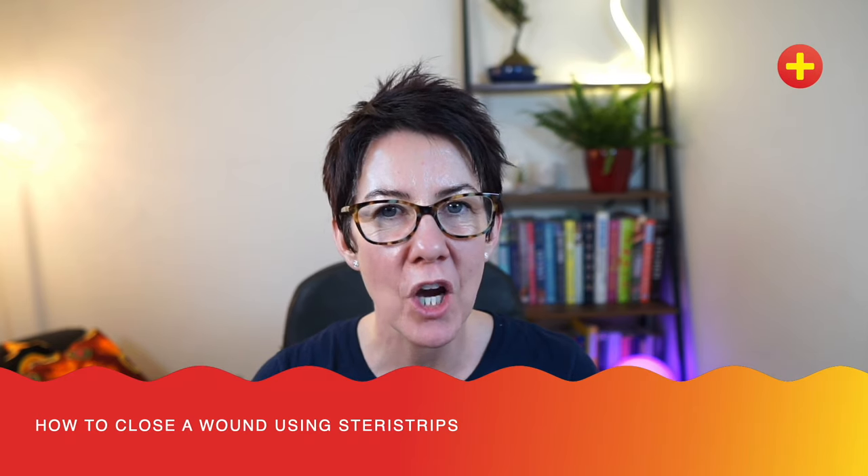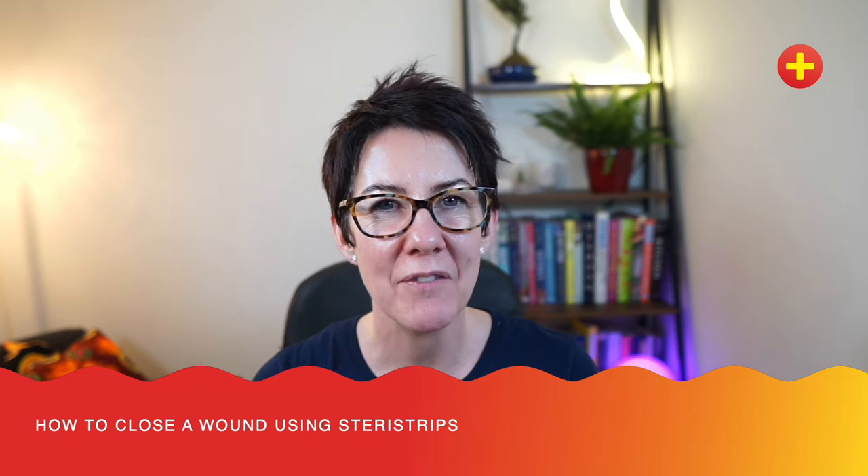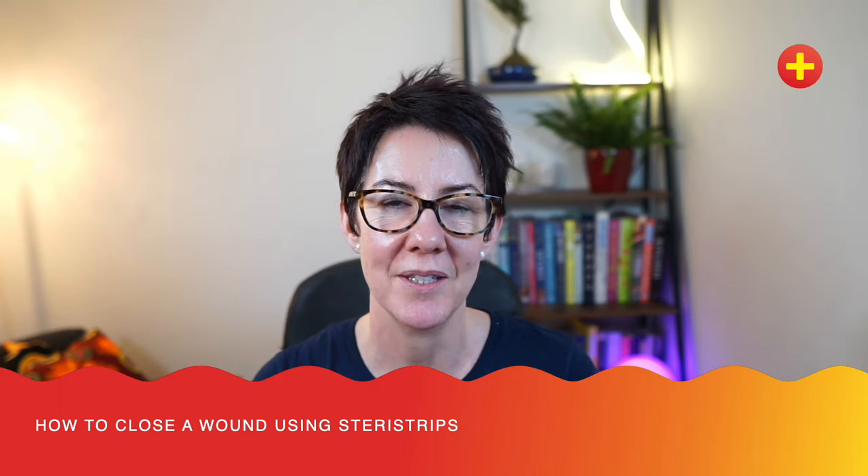This is a really common procedure in PED and many of the wounds that we see are suitable to be closed this way. What I really like about using SteriStrips is that you have the ability to approximate the wound bit by bit and to test the cosmetic outcome as you go along. This is especially useful if you're worried about tension across a wound and its position in relation to Langer's lines. You don't have to completely commit yourself first time like you do with glue.